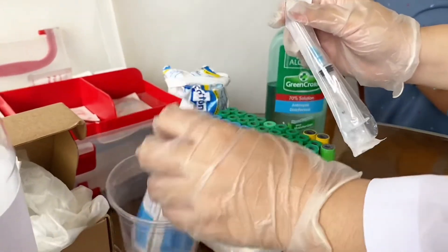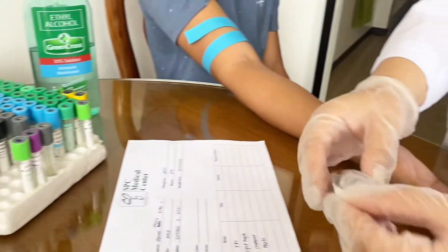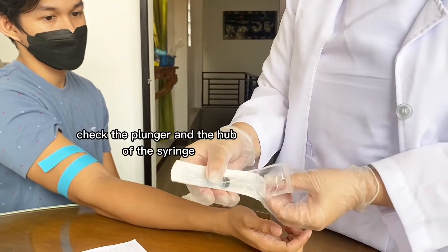Discard the used cotton. After opening the syringe, please check the hub and the plunger for suction.